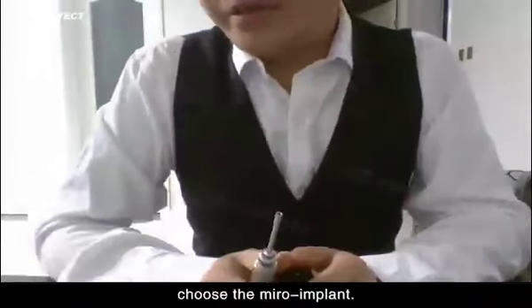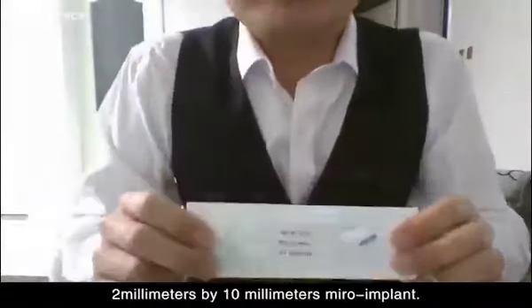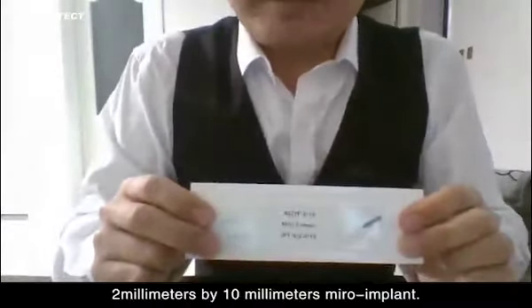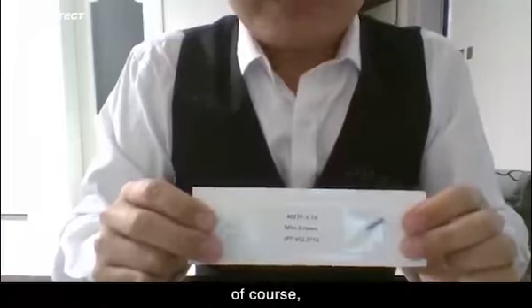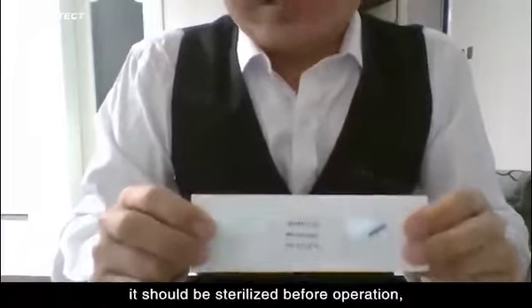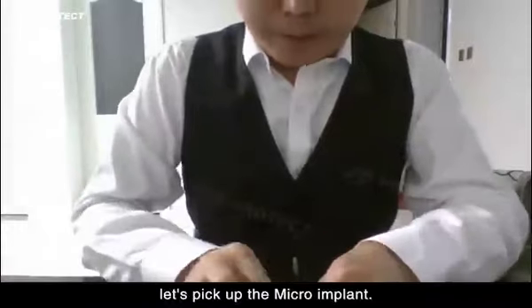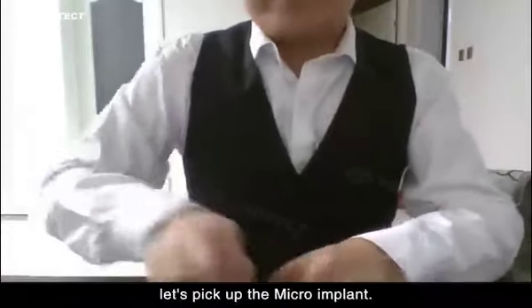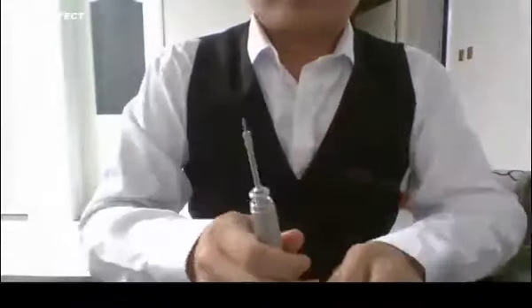Choose the micro-implant. A 2 millimeters by 10 millimeters micro-implant should be used. Of course, it should be sterilized before operation. Let's pick up the micro-implant. It's okay.